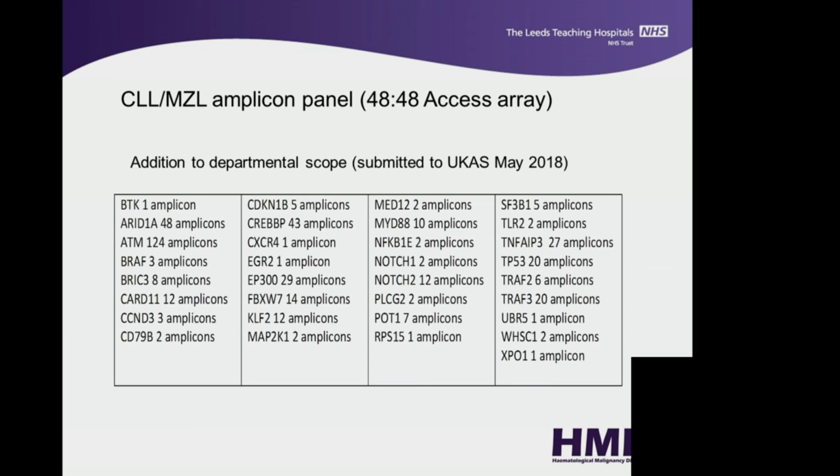What are we doing now? Well, currently, in addition to our existing scope, we are interested in looking at CLL and marginal zone lymphoma, mainly because we've got a great interest in CLL. We've got Pete Hillmen in the lab, and Roger Owen, who's interested in Waldenstrom, so we've got a clinical interest, which is why marginal zone lymphoma is included. Ruth, I just noticed, has gone out, but she's also very much into Waldenstrom's macroglobulinemia and splenic marginal zone lymphoma. So we've got a similar series.